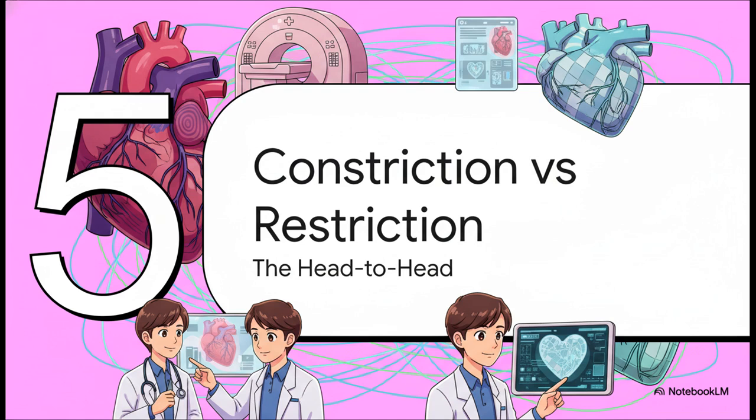Okay, so this sets up one of the great diagnostic challenges in cardiology. Constriction, that squeezing sac, and restriction, that stiff muscle, can look and feel very similar to a patient. But they are completely different problems with completely different treatments, and MRI is the perfect tool to tell them apart.